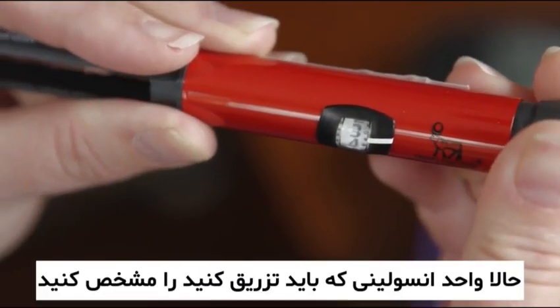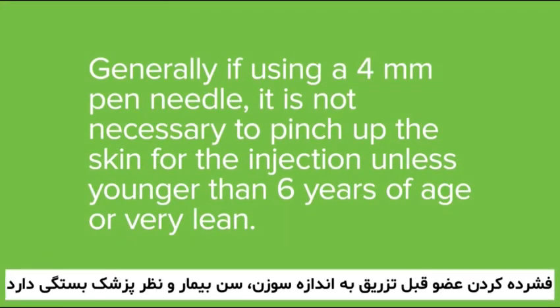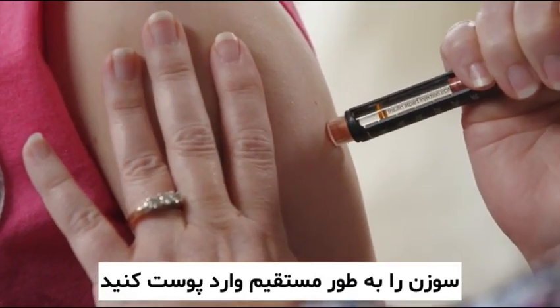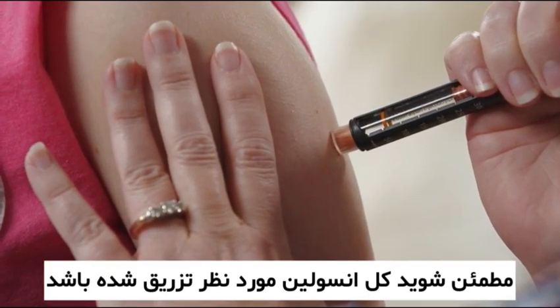Dial your correct dose of insulin. Follow the directions given to you by your diabetes educator on whether you will need to pinch up the skin for the injection. Inject the needle straight into the skin and push the button with your thumb. Make sure all of the insulin was injected.